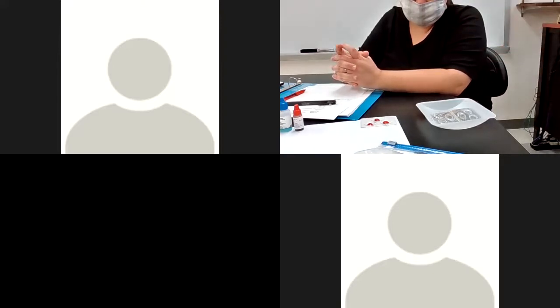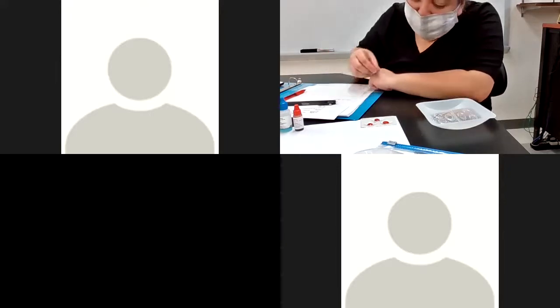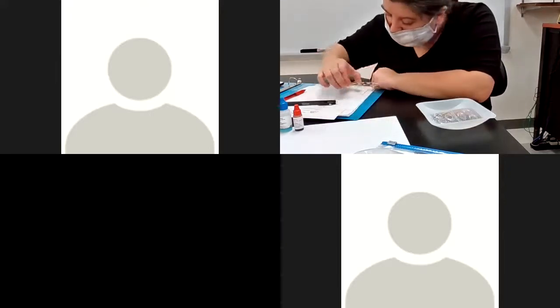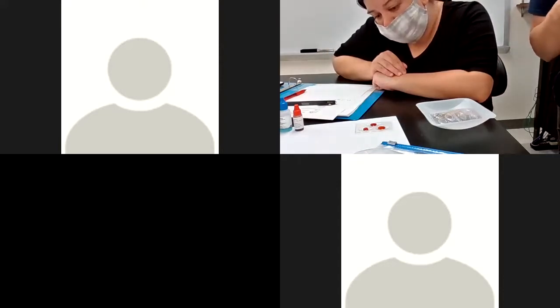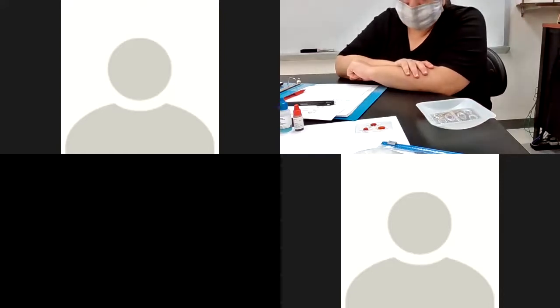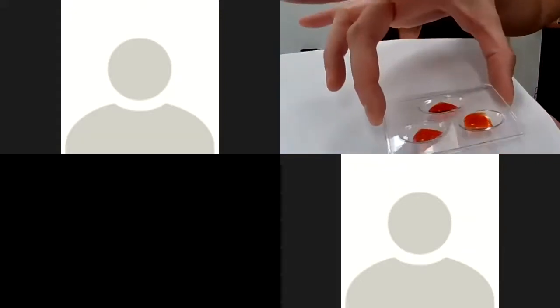Okay. Does anybody see anything happening yet? What did you say the different ones would look like again? So the A well looks like glass forms on it. It almost looks like ice forms on it, or a piece of hair or string is sitting on top. And then the B will change a slightly little orangey color. I think that's the B. Yeah, it's changing. It's probably hard to see online, but is this second one the B? So A, B, and then RH.